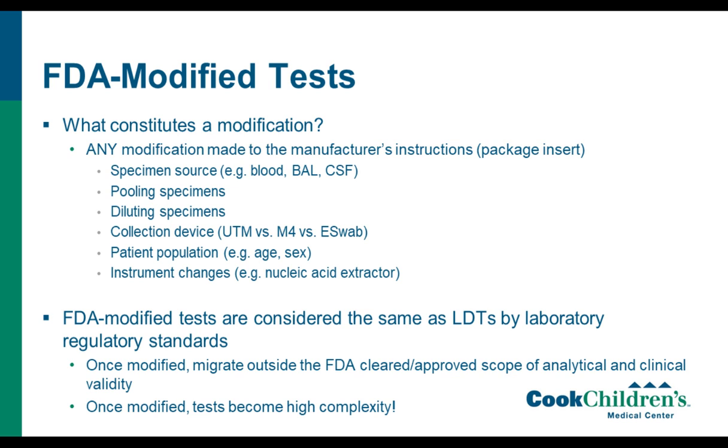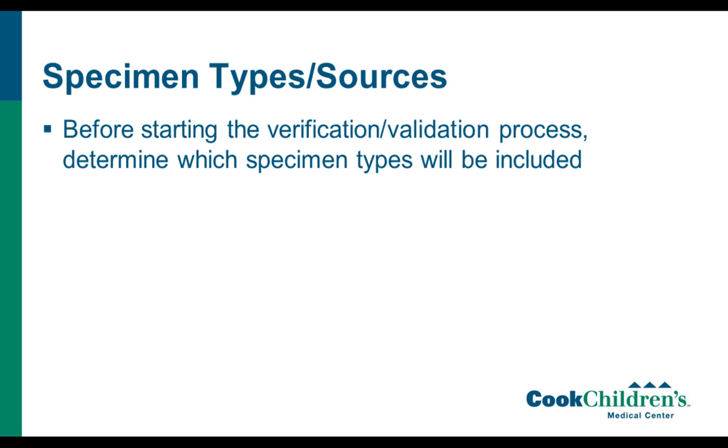And in addition, once you modify any test, it becomes high complexity. So if you are using an FDA-cleared test that's considered moderate complexity and you're using it off-label, it's now automatically high complexity, which changes the personnel requirements as well.